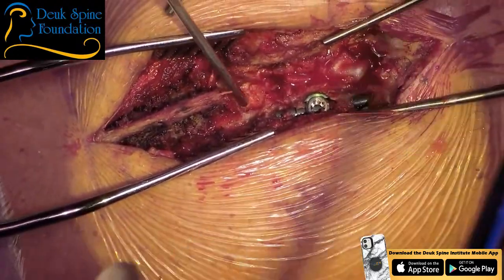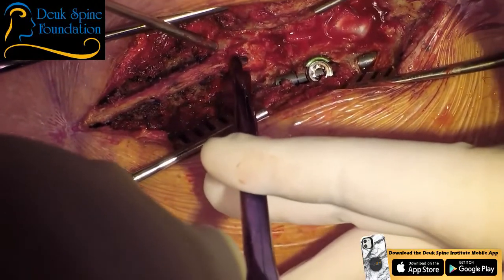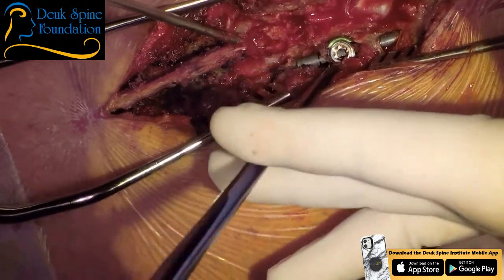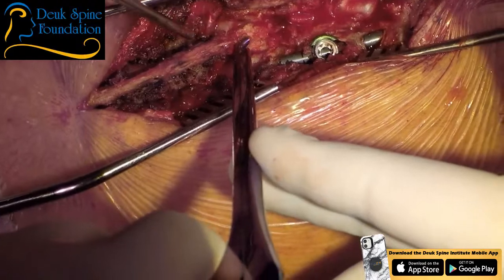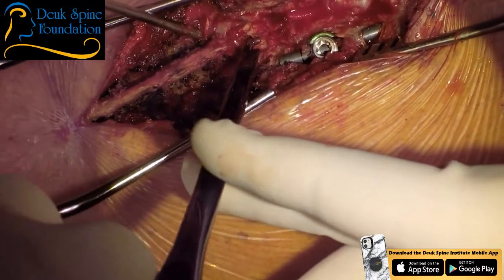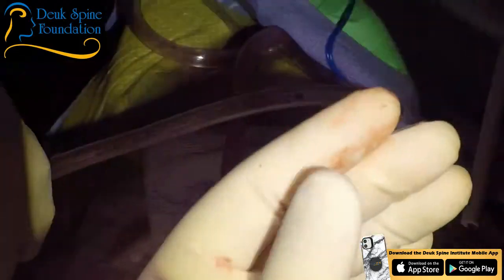All right, it's important to understand that I am starting at the normal area of vertebrae. Why? Because there's less likely to be scar tissue here. And scar tissue can hold the dura or spinal cord to the bone that we're trying to remove. So it makes the anatomy abnormal.